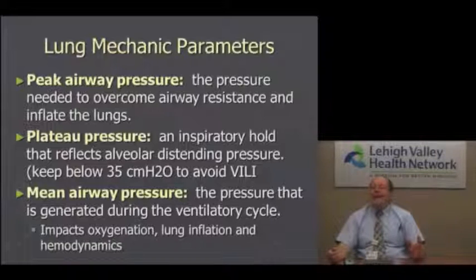But keep in mind, it may have a negative sequela on your hemodynamics, and as you increase pressures, volumes, and PEEPs, you also increase the chance of ventilator-induced injury. But the mean airway pressure is what you have to go after, and again, it's a balancing act. Do I take a moderate increase in PO2 as long as my blood pressure stays stable, or do I need a high mean airway pressure and then have to augment hemodynamic performance with vasopressors or fluids? It's a tough decision sometimes, and this is why this is difficult. That's why, with patients in the ICU, or you guys flying real sick patients in to us, it takes a great art to manage these patients, not just a science.